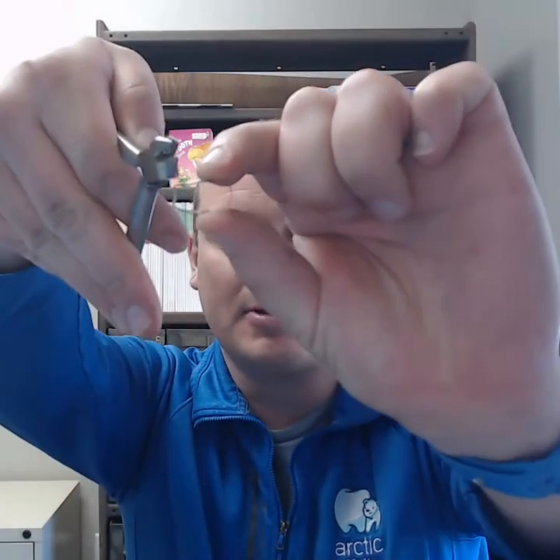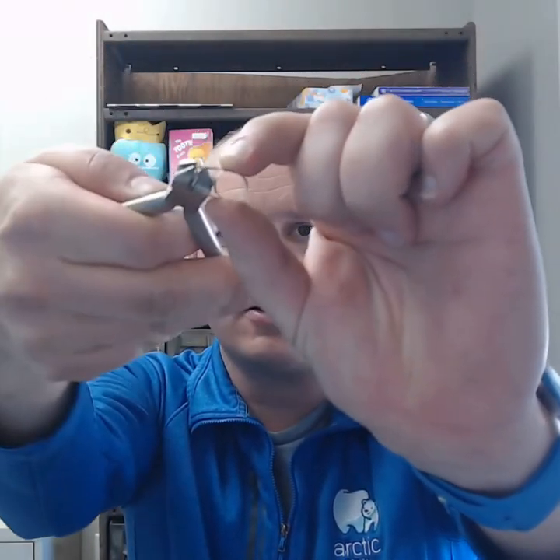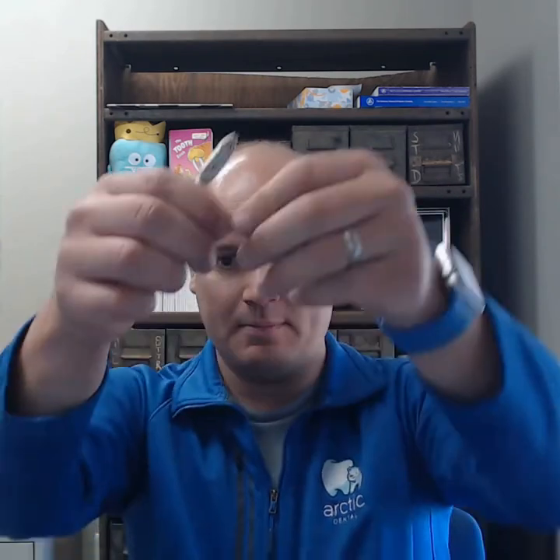Sometimes when these come back, they're usually about a millimeter to a millimeter and a half too long, so you're going to have to adjust the banded loop. One of the problems is if you take the band and adjust it with your three-prong and bend it on all three sides, you're going to bend the band. So my tip today is to go ahead and find the best fitting stainless steel crown out of your box and place that inside the band and loop.